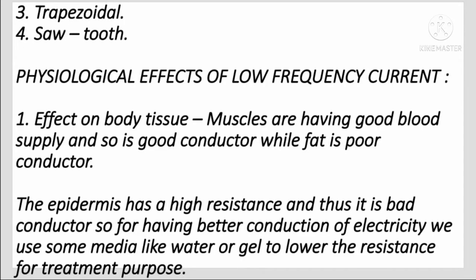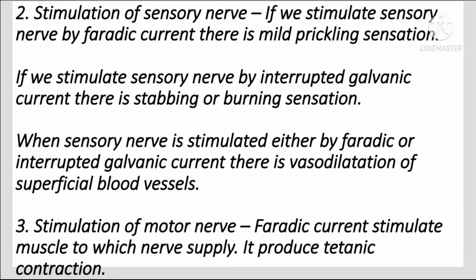Physiological effects of low frequency current. Effect on body tissue. Muscles have good blood supply and so are good conductors, while fat is a poor conductor. The epidermis has a high resistance and thus is a bad conductor. So for better conduction of electricity, we use some media like water or gel to lower the resistance for the treatment purpose.